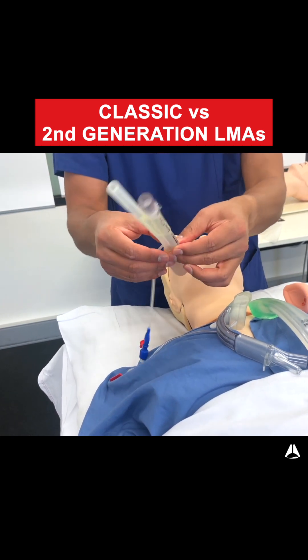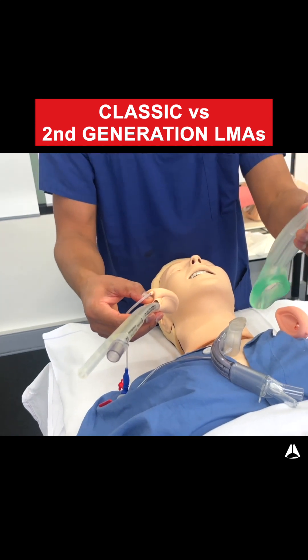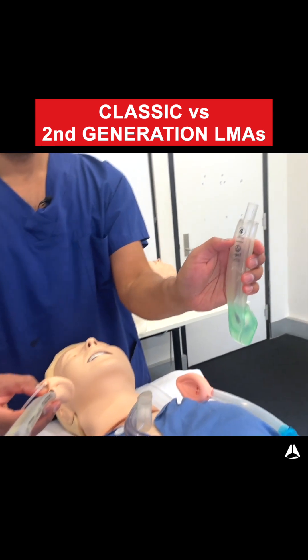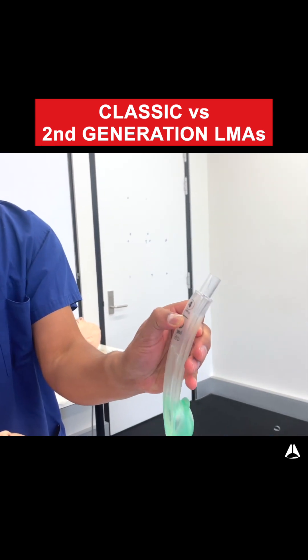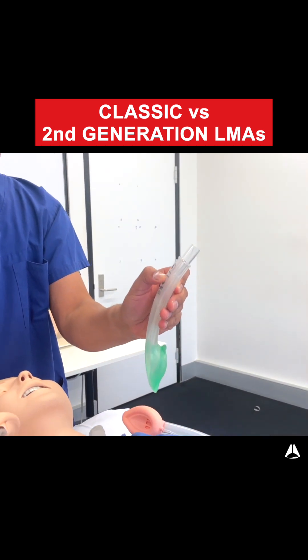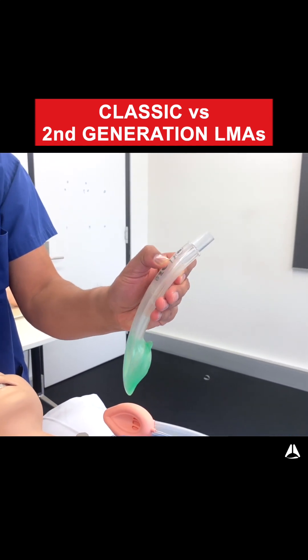They also all have a bite block. On the iGel, you can see this is a really firm structure sitting at this line — where your teeth would be. It's very strong plastic, which means if the patient bites down they can't obstruct the airway here, which is really important. An obstructed tube is obviously a real problem for ventilation.